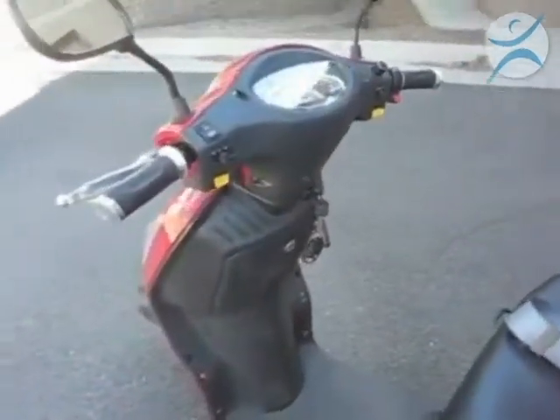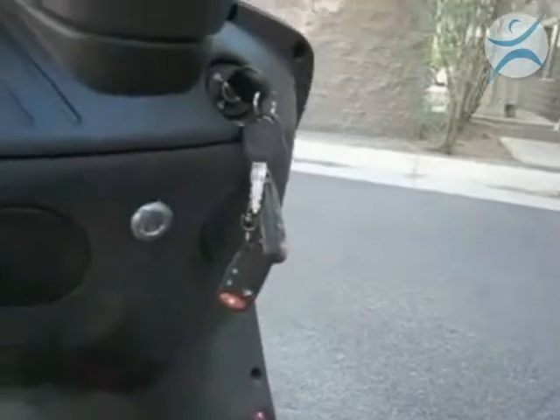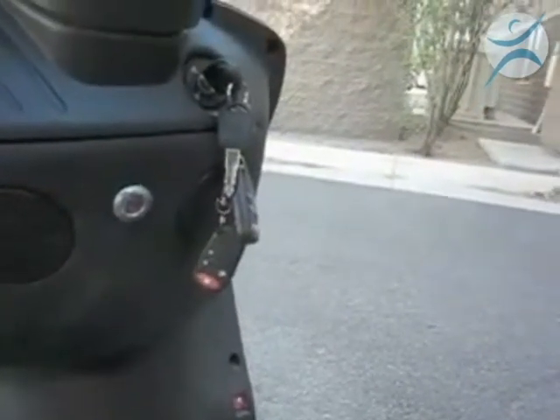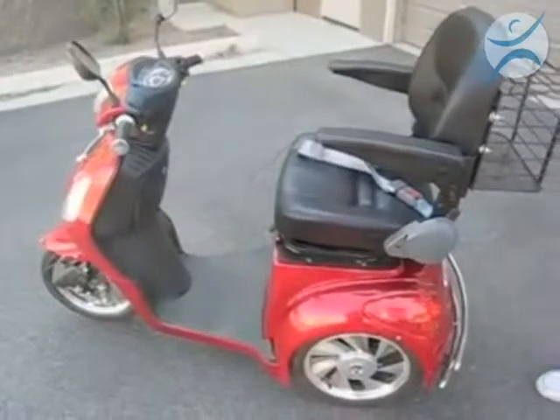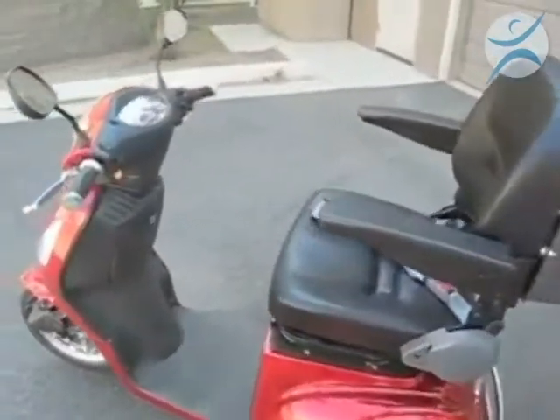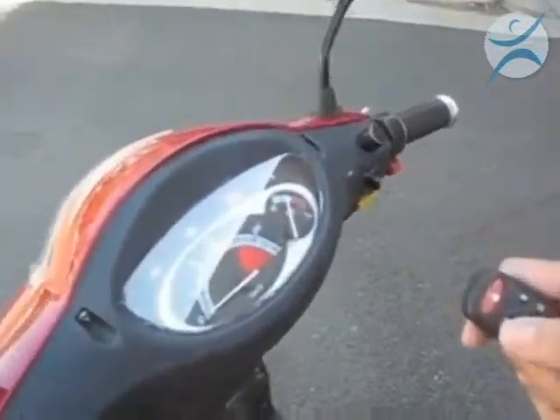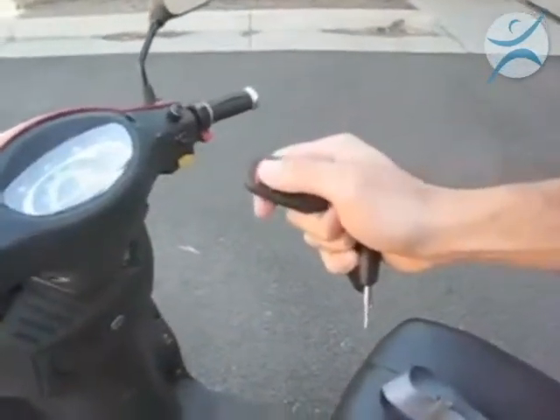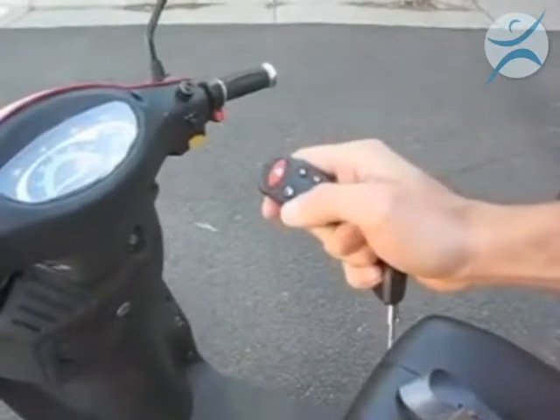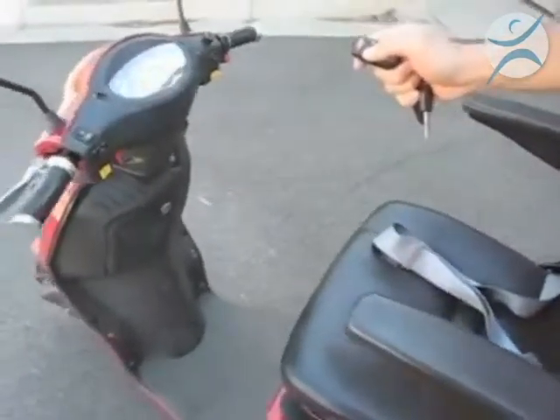The EW36 also comes standard with a key remote fob. From the key fob, you can actually turn the power on or off on the scooter. The other feature of the key fob is the alarm system — by pushing the red lock button, the alarm is activated. And if somebody touches the scooter, the alarm will activate and all the lights on the scooter will flash.